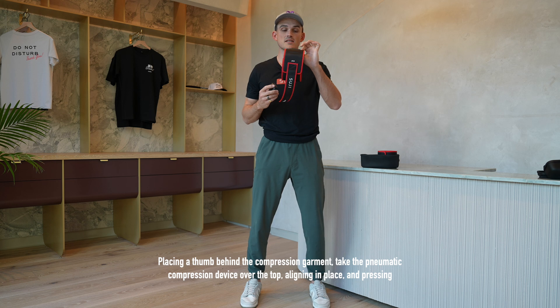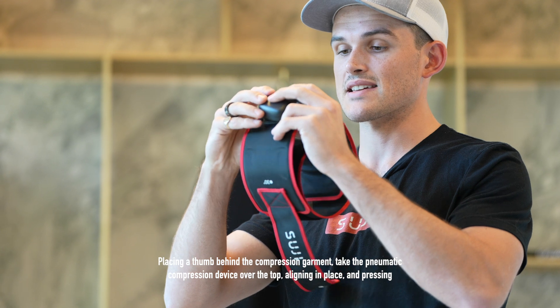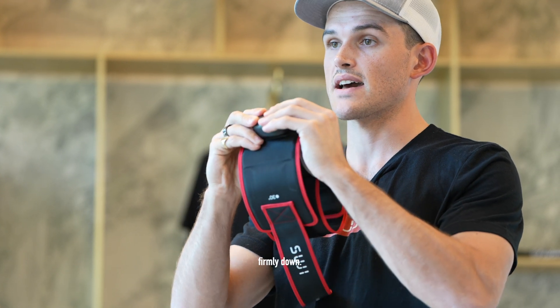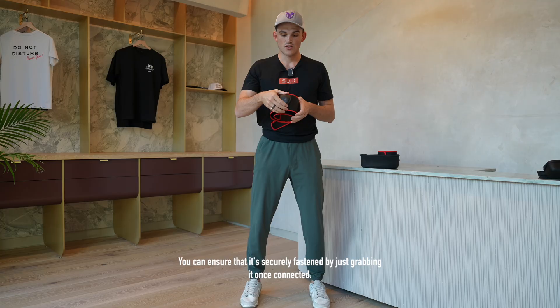Placing a thumb behind the compression garment, take the pneumatic compression device over the top, aligning it in place and pressing firmly down. You should hear an audible click of the magnets connecting. You can ensure that it's securely fastened by just grabbing it once connected.